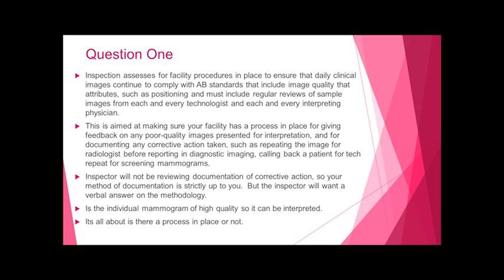It must include regular reviews of sample images from each and every technologist and each and every interpreting physician. So this is aimed to make sure your facility has a process in place for giving feedback on any poor quality images presented for interpretation and for documenting any corrective action taken, such as repeating the image for the radiologist before reporting, in diagnostic imaging, or calling back a patient for tech repeat for screening mammograms.